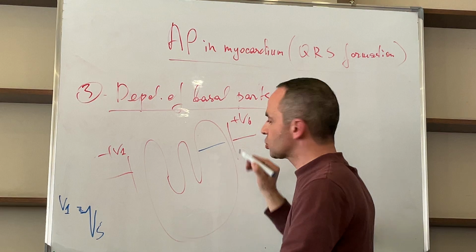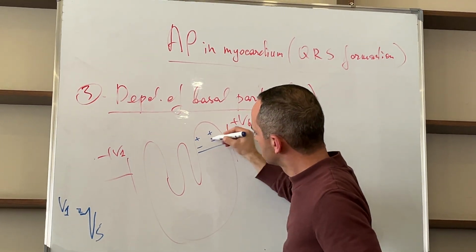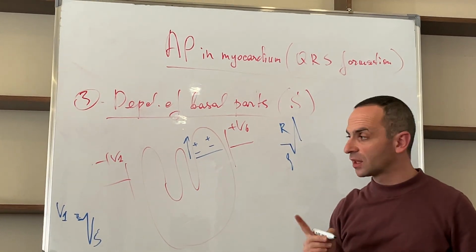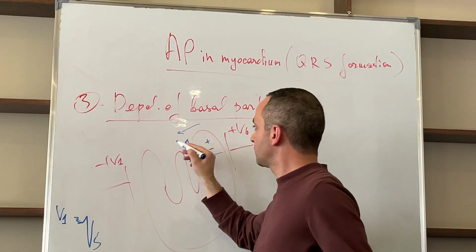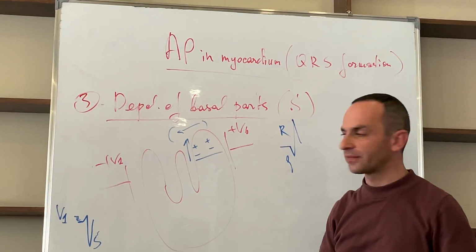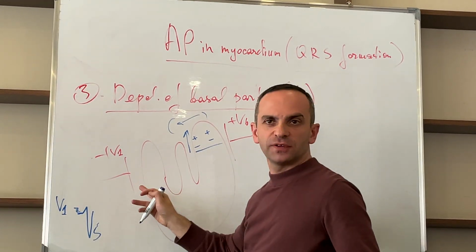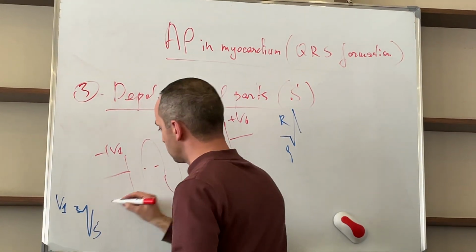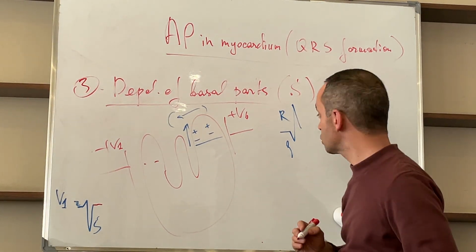And we have depolarization of basal parts. Direction of depolarization is like this, down to up. But we consider it like it has opposite direction. It will be like this, because then it is projected like this. So, it doesn't have any impact on right ventricle. For right ventricle, now everything is negative. It is isoelectrical line, ST segment formation.